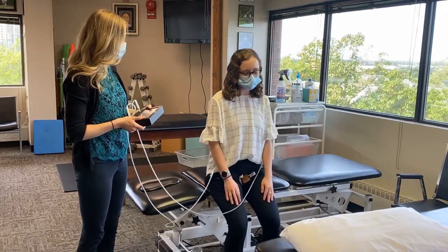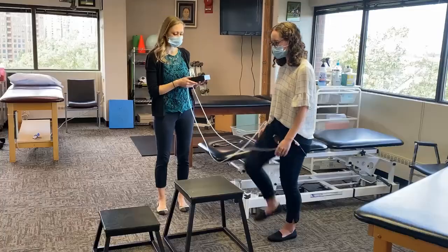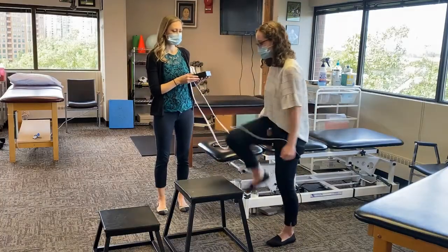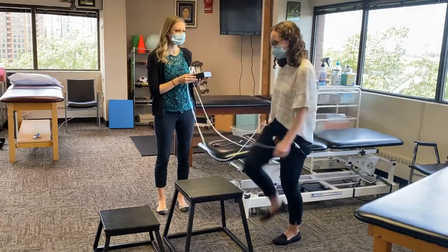Research has shown that even with low intensity exercise, which is about 20-30% of maximum contraction, improvements have been seen in both size and strength of muscle. These gains have been shown in as little as three weeks.